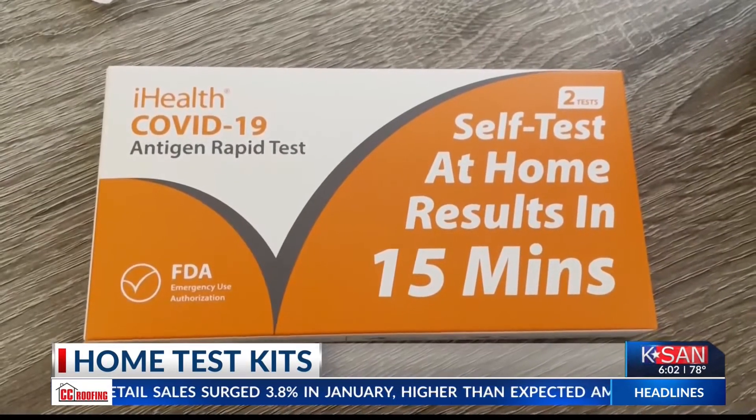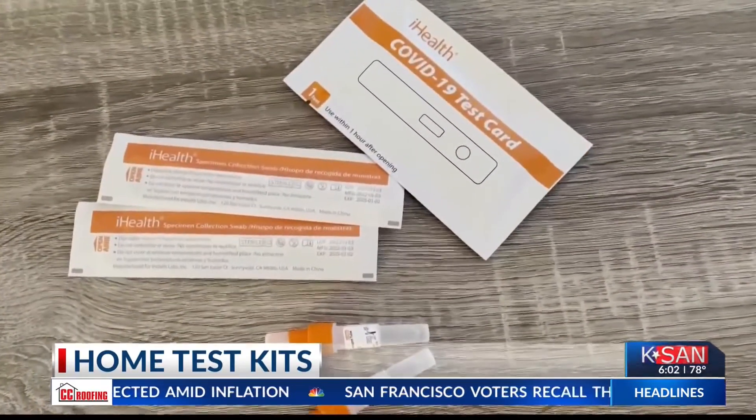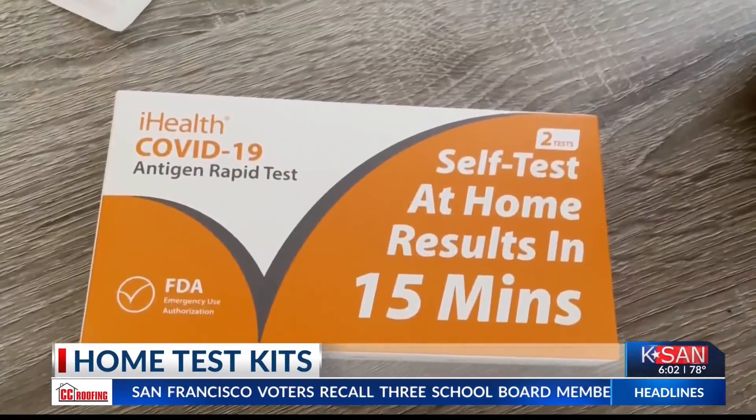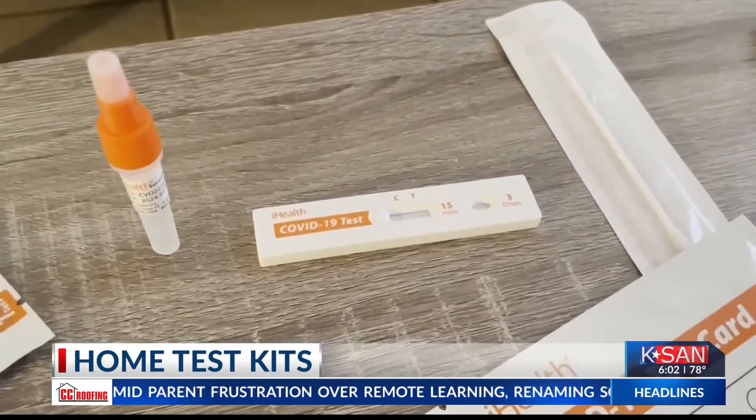The test detects a protein called antigen, and if the protein is present, two lines will appear on the test strip. On the test, you will find the letters C and T. The C stands for control, and the T stands for test.